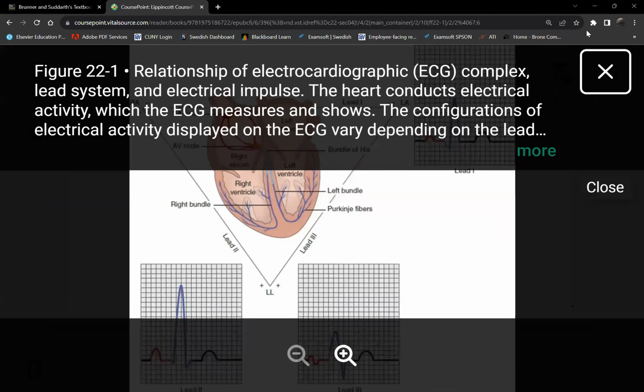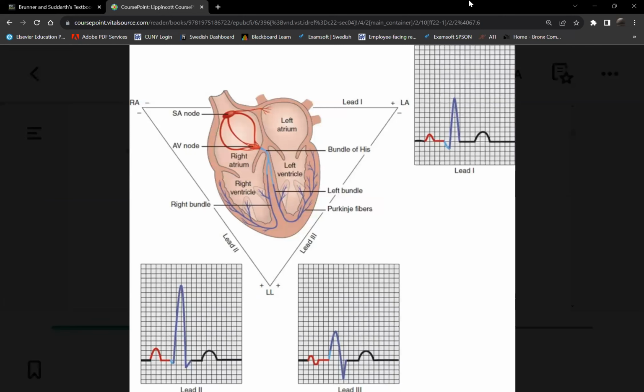This lead is bipolar. Look at the lead on the left arm. It carries both a positive and a negative. Because of that, it will give you 2 views instead of 1. Okay, so that completes the 12 views. But now when we say 12 views, consider it a 360 view of the heart.